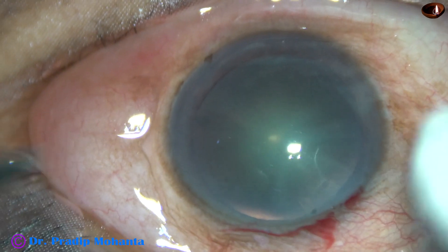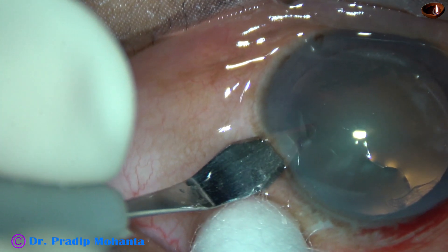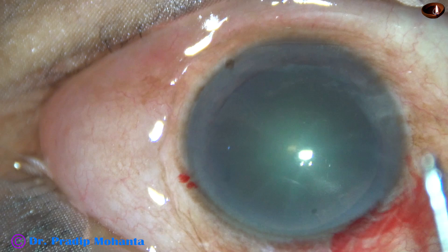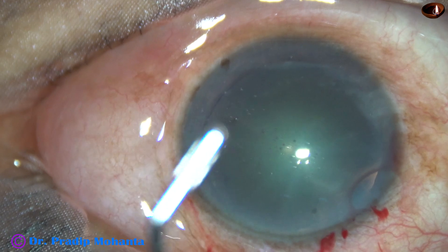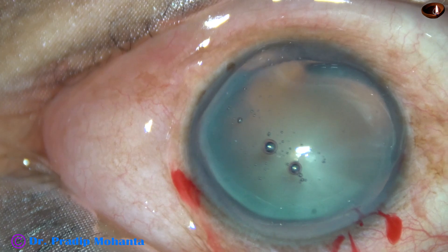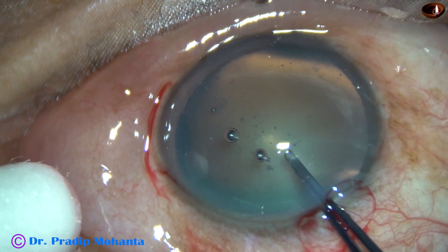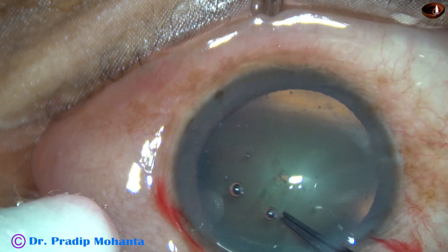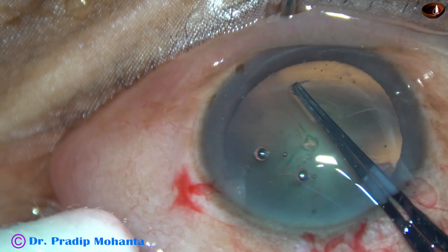This pre-chopper is particularly useful for soft cataract cases. In hard cataract cases, we can hold the nuclear mass with high vacuum and chop with a chopper. But in soft nucleus cases, where the nuclei are soft, it is very difficult to hold the nuclear mass with vacuum and chop. In such cases, it is very useful if we can pre-chop the nucleus with a pre-chopper.